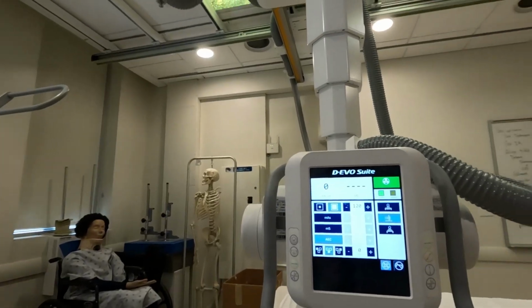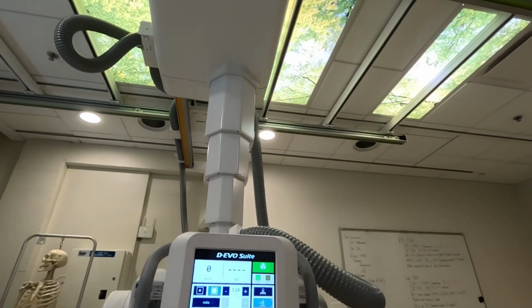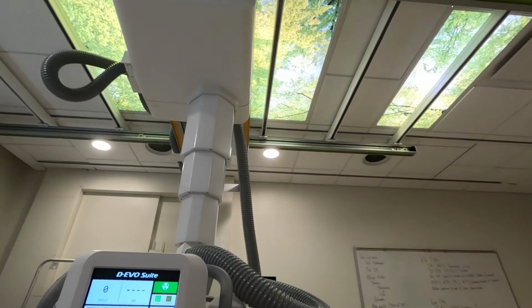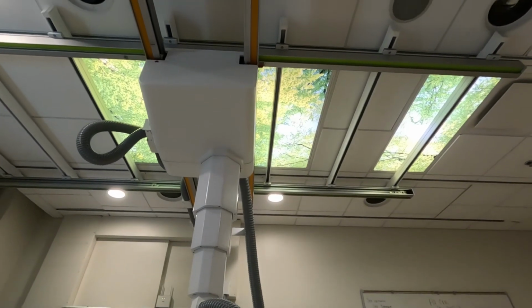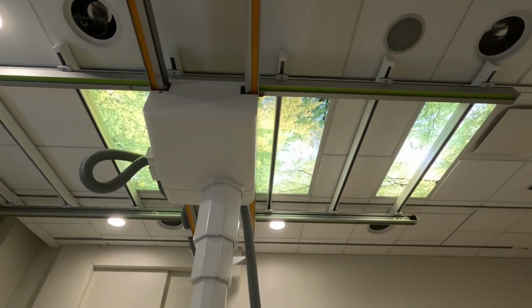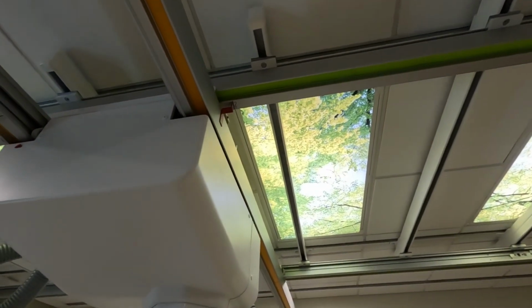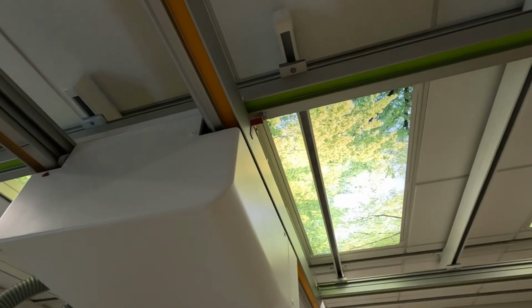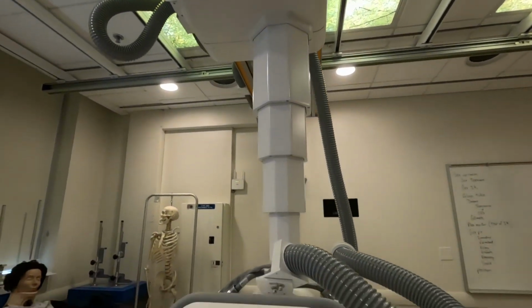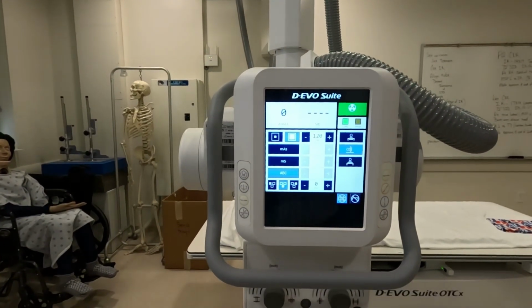So if I tilt this back and we look up at the ceiling, I'm going to have to move this a little bit, you should see where it is locked in or pointing to that 72 inches. I'll pick it up and bring it up a little bit so that you can see a little bit better. Hopefully you can see where that says 72. So that is what we refer to as a preferred detent. Our chest X-rays, we're going to shoot 72 inches.